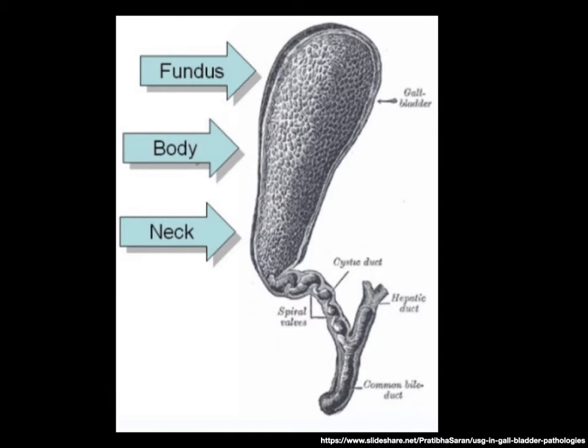The gallbladder has a fundus, a neck, and a body. The neck is especially important to evaluate because stones tend to get lodged here and can cause some trouble once they get there.